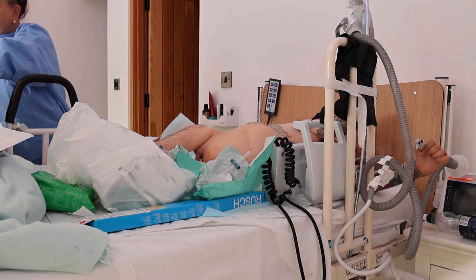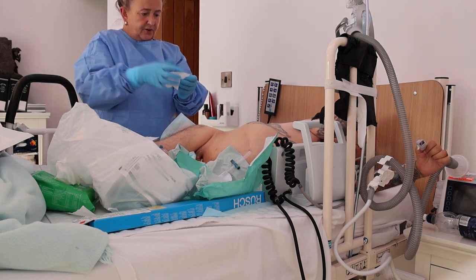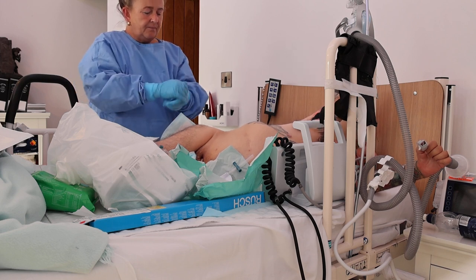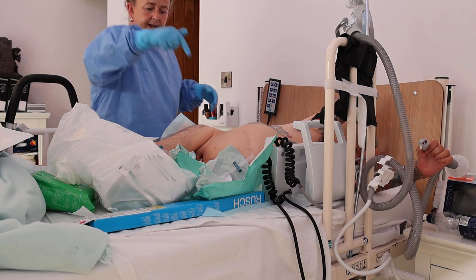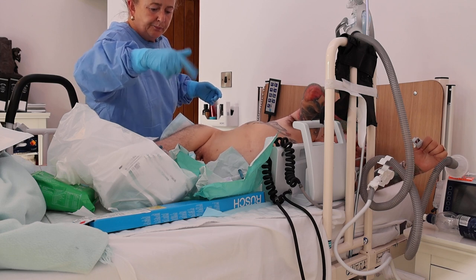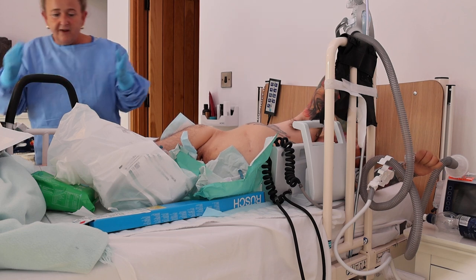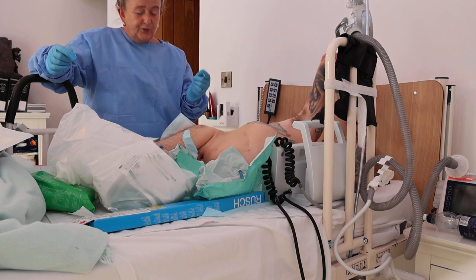What I continue to do throughout, as much as I can, is wipe my hands with a clinical wipe, even though I'm going to put another double glove on in a minute. This is just cleaning gloves. In here, I have the size of the catheter that's going back in. I have instillagel ready. See, it's gone down, so 127. I'm going to go straight in and do this now. And like I said, everything has to be sterilised. This is his first catheter change, mind you, so it's new.